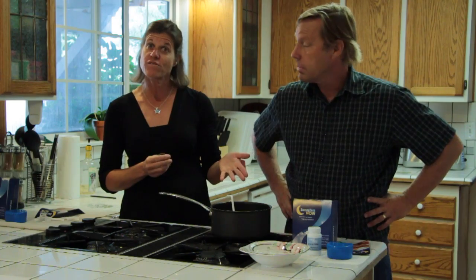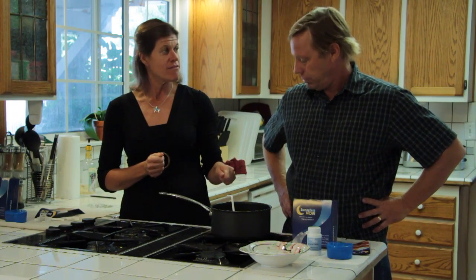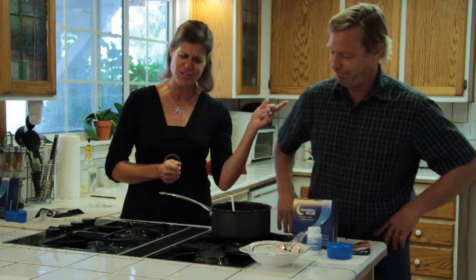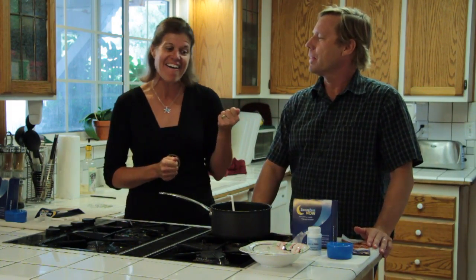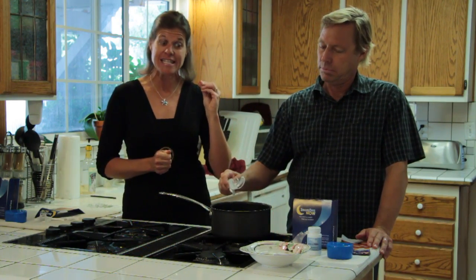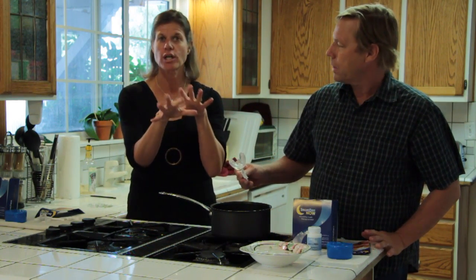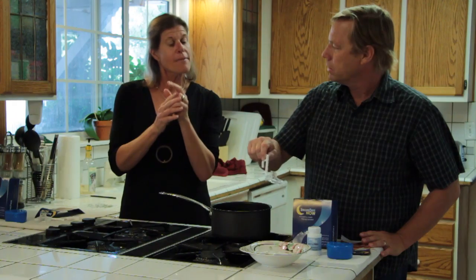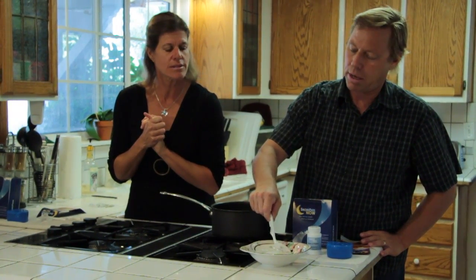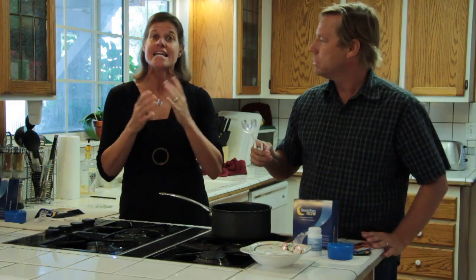It would go for about 50 seconds. Okay, 5-0. Just about a minute, but not quite a minute. That's very true. Then you're going to take it out, and we're going to put it into ice water. Same theory exists. You want to make sure that you are going to cool this off. How long in the ice water? About 2 to 3 seconds. So 1,000, 2,000, that's about right. 3 seconds. All right. Perfect.